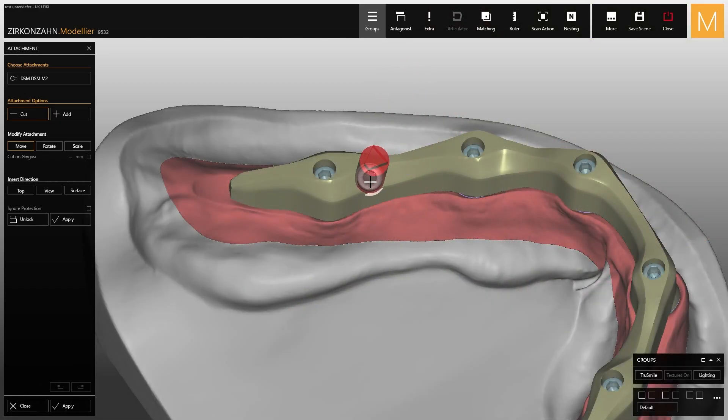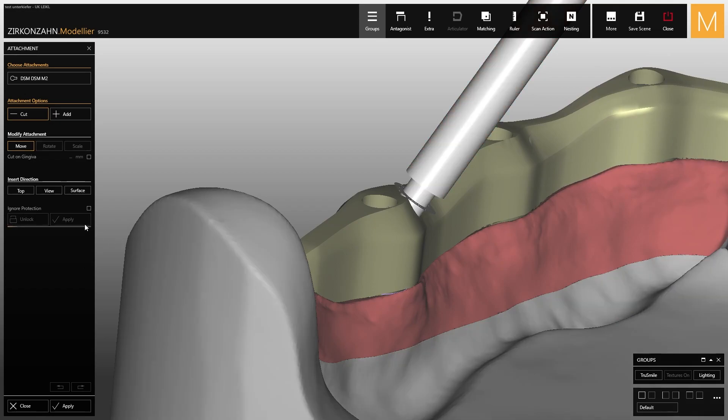Among these parameters, try not to tilt the attachment too much during positioning. Once the placement is complete, select apply to create the screw seat.